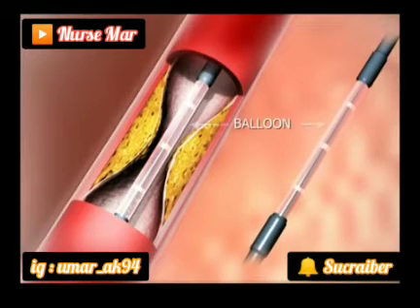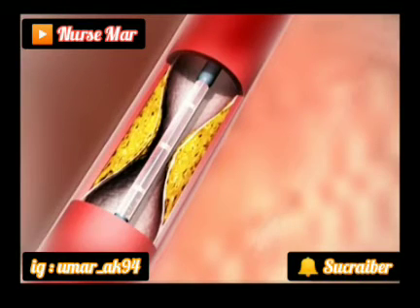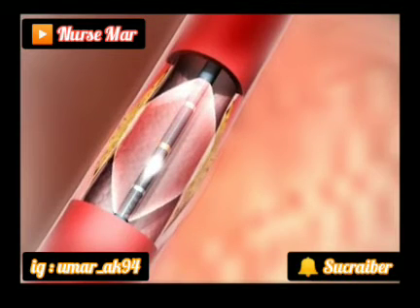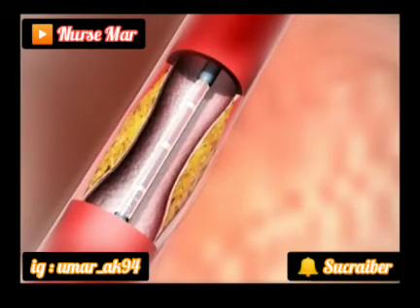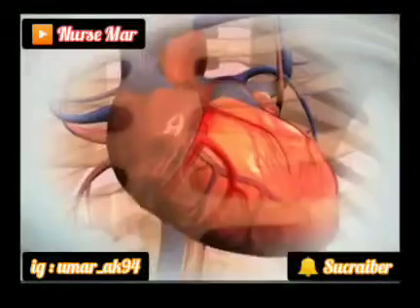A deflated balloon is placed at the tip of the catheter. After the tip of the catheter reaches the blocked segment of the heart artery, the balloon is inflated. With the inflation of the balloon, the plaque is flattened and the blood vessel is opened up. The balloon is then deflated and removed.